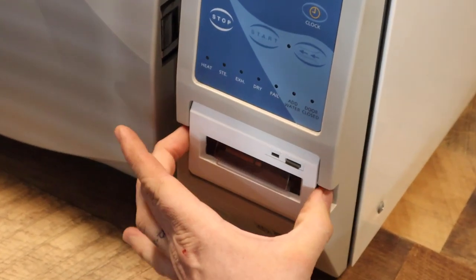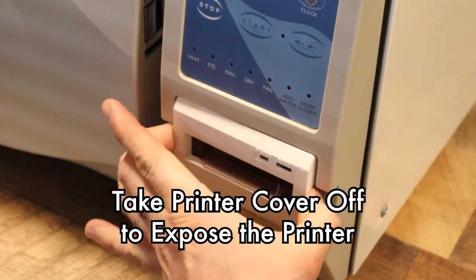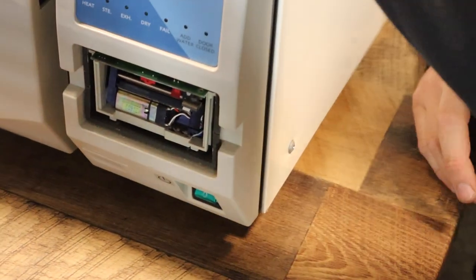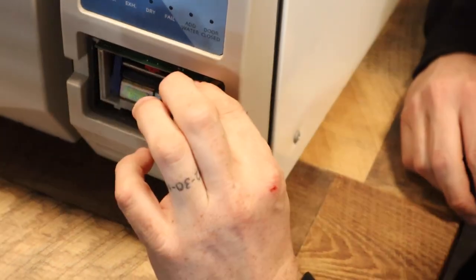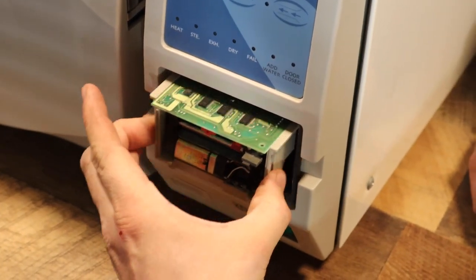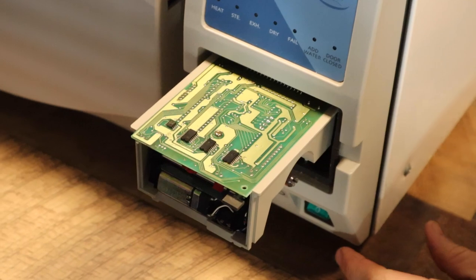First thing we're going to do is squeeze on either side of this door. There's two little buttons. When you press those, this door will pull off. The next thing we're going to do is grab by the button and just kind of pull out a little bit, and the whole printer will slide out as such.